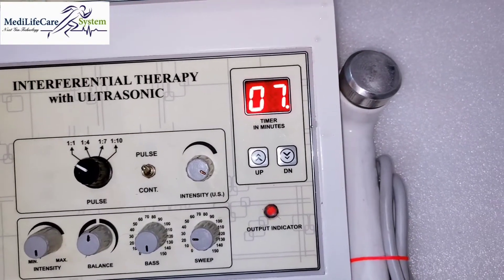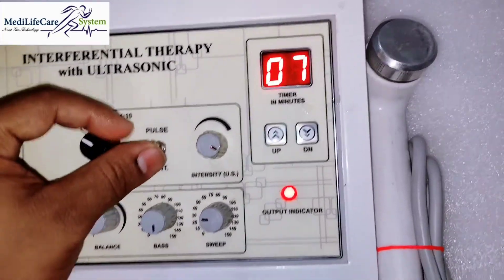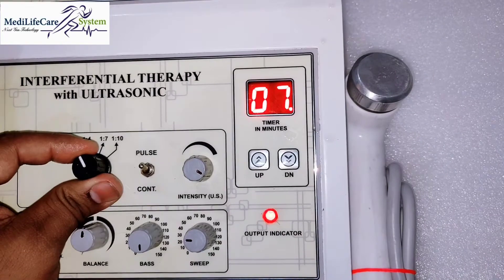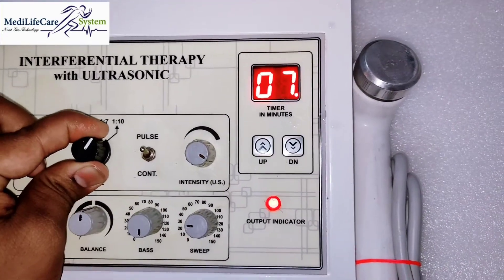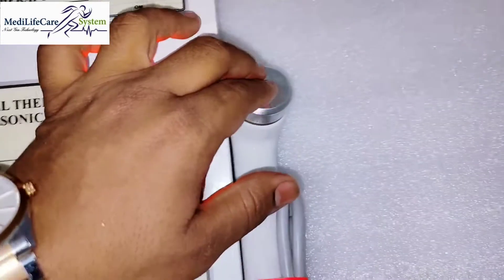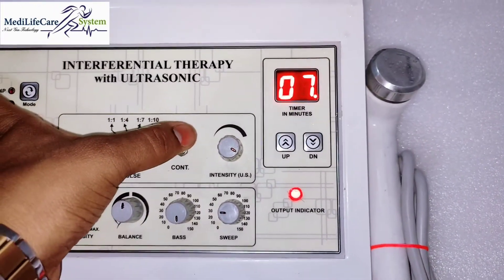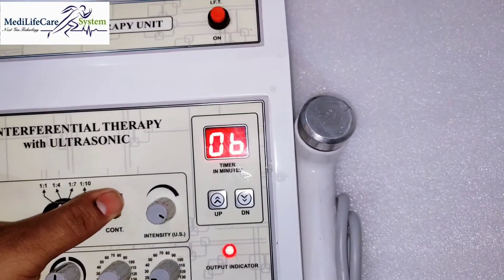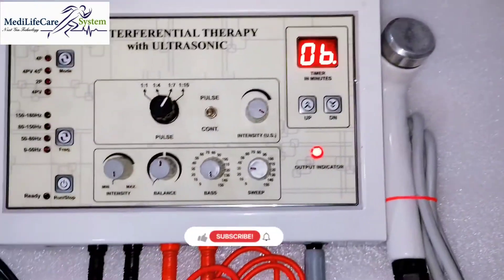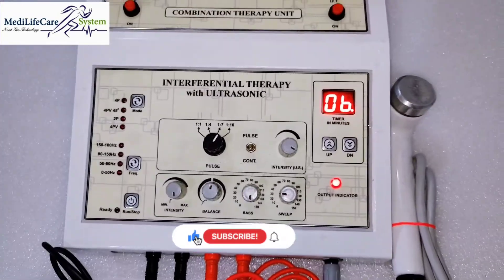You can see this is the pulse. You can change from here: 1 to 4, 1 to 7, and 1 to 10. This is the power setting. For continuous mode, simply bring it down and you can see the output. There is an output indicator so you can see that the machine is working.